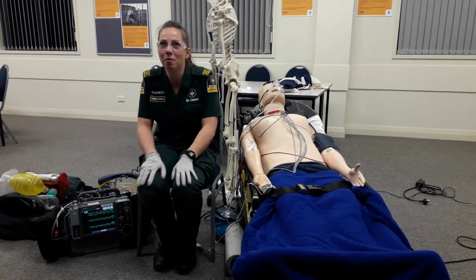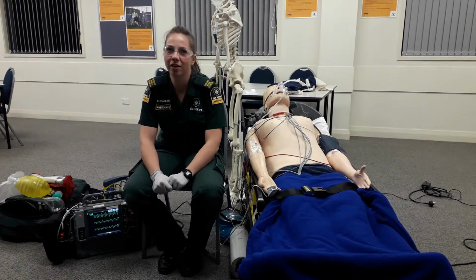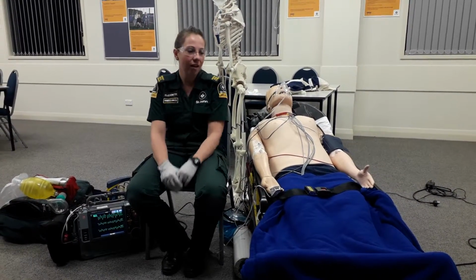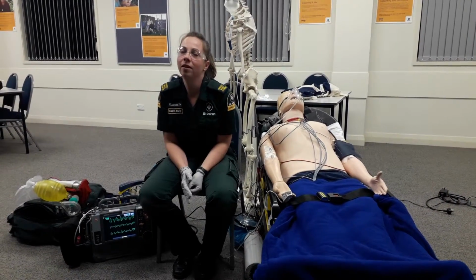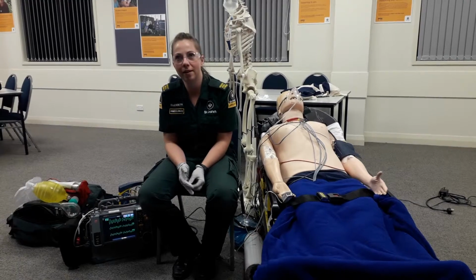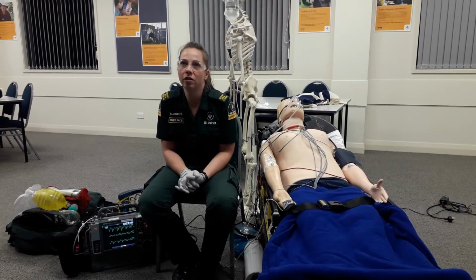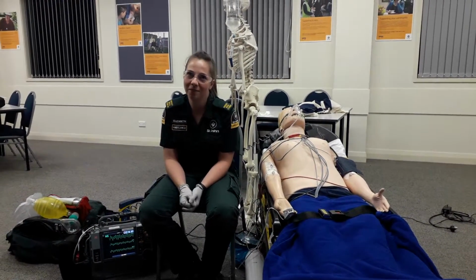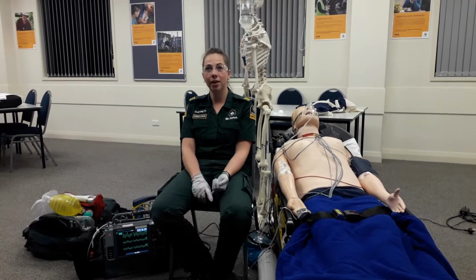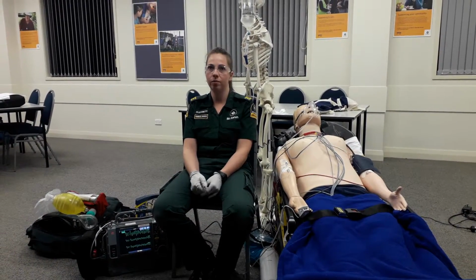Right, my name is Elizabeth McCarthy and I'm going to demonstrate the safe execution of synchronised cardioversion. In this scenario we have a patient, a 55-year-old male. His chief complaint is chest pain with collapse today. His history was acute onset of chest pain with a collapse following dizziness. His past medical history is hypertension, ischemic heart disease, previous MI 5 years ago.